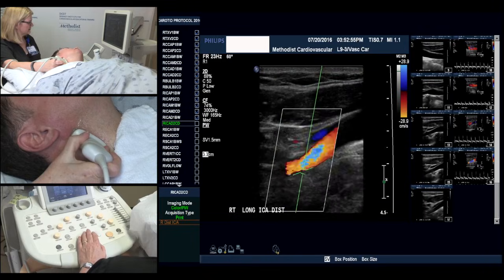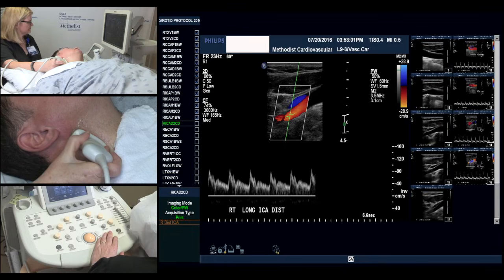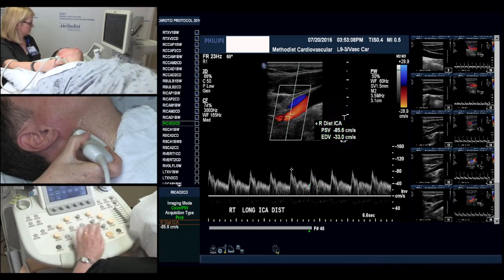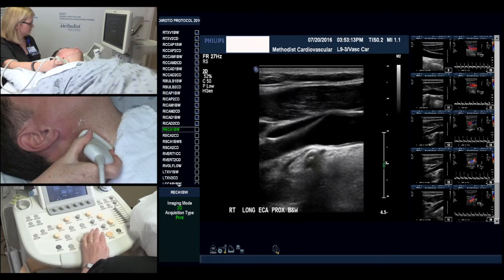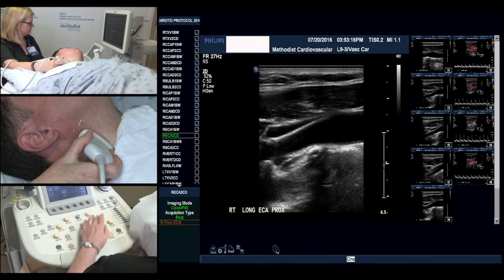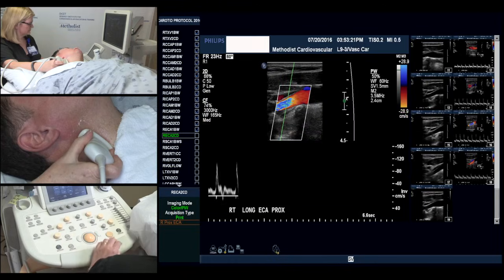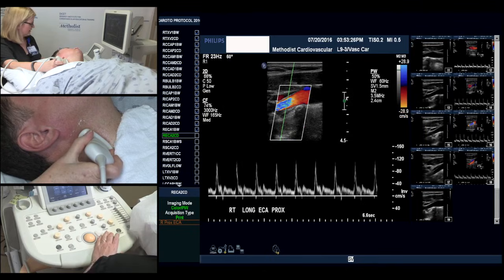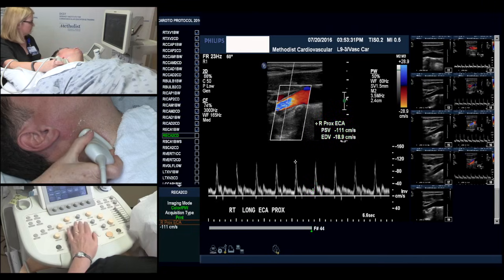Adjusting our color box size and position. And from here we go into the external by slightly pushing forward on the probe. Here we have a high resistance signal in our external carotid, which is normal.